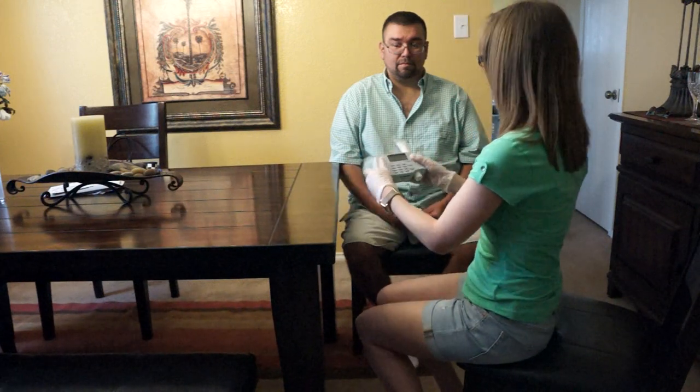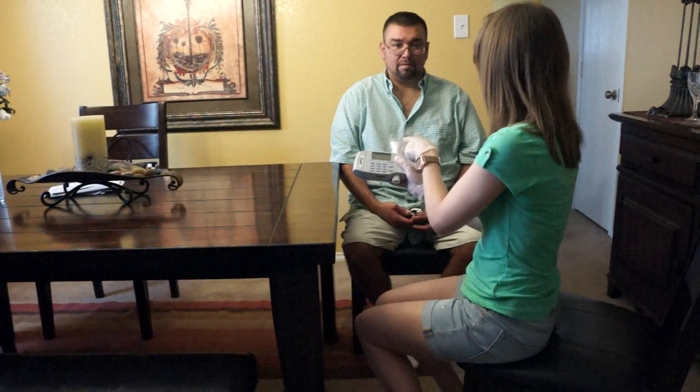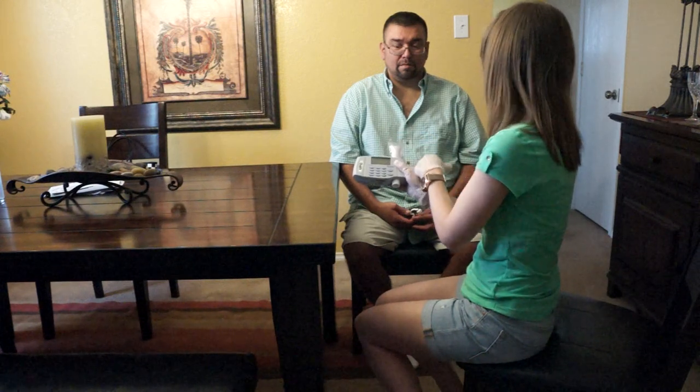Okay. Now the trick with this mouthpiece is you want to make sure that you put your mouth in all the way, okay? You put your tongue underneath because that can occlude the whole test, and you want to make sure that the only air being sent is in the mouthpiece and not out your nose or out your lips. That's why you have to do a good tight seal. Do you understand that so far?